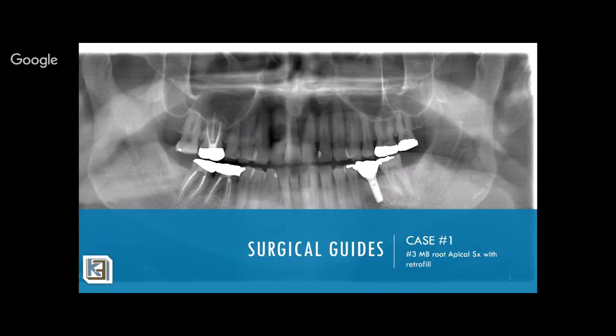Okay. Somebody was asking which CBCT machine you are using. I actually use the Sirona Orthophos SL. I used to have the Carestream. I love the Carestream. Their definition is amazing. I know Blue Sky Bio carries the Carestream machine. The only reason I switched to Sirona was the ease of use.